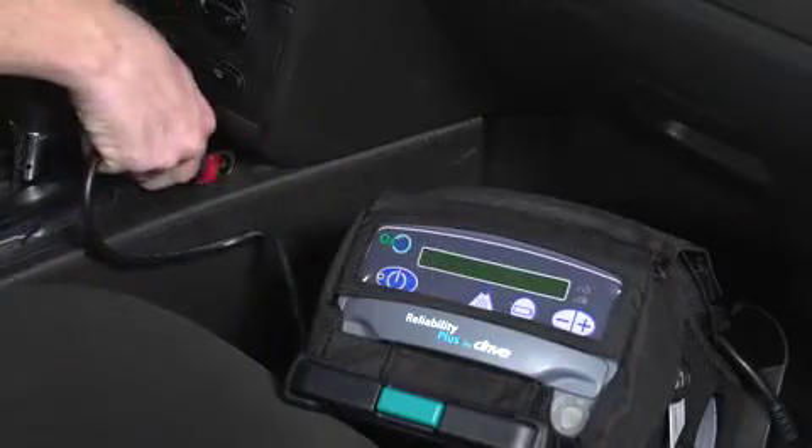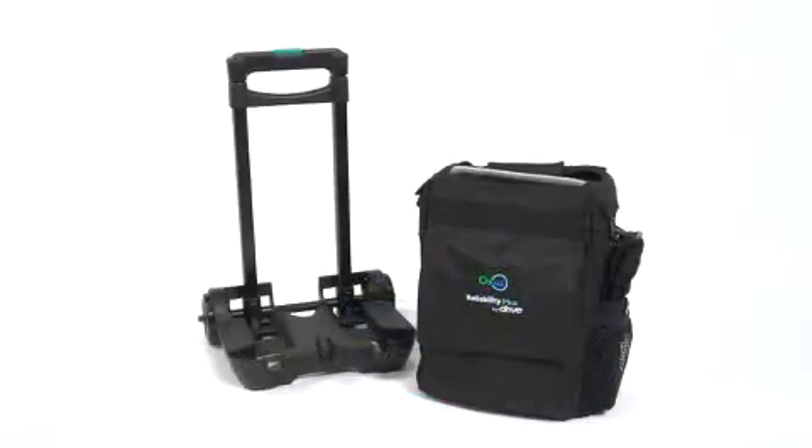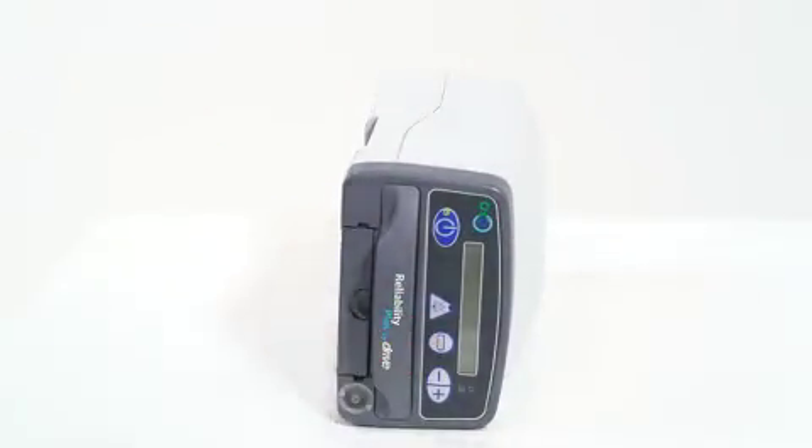Or you can plug your Oxus into a wall outlet or a car charger for added convenience. And if you're traveling, the Oxus is FAA approved and comes with a mobility cart and durable carry case to make traveling a breeze. It even operates in any position, allowing it to be safely stored under the seat in front of you.